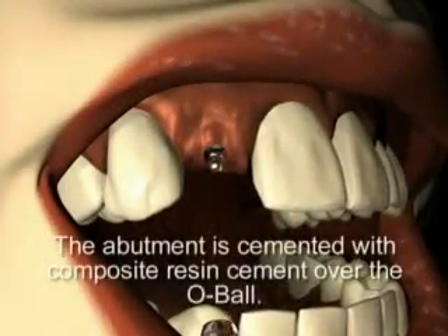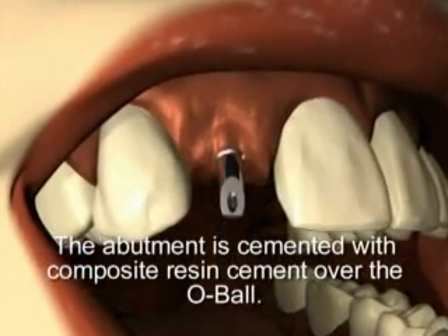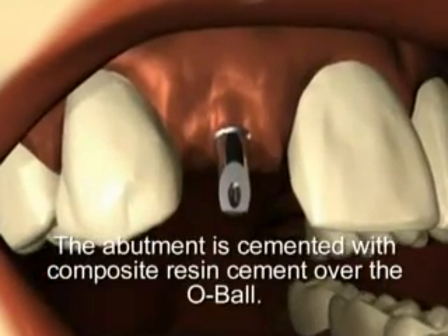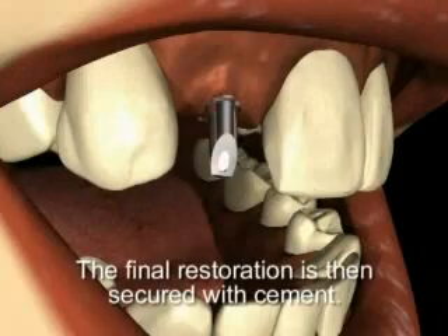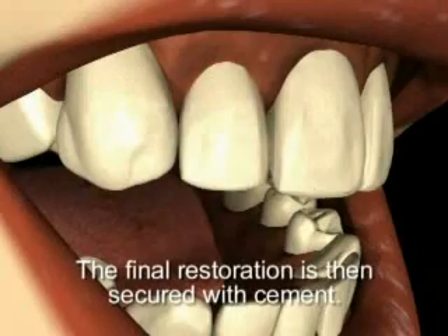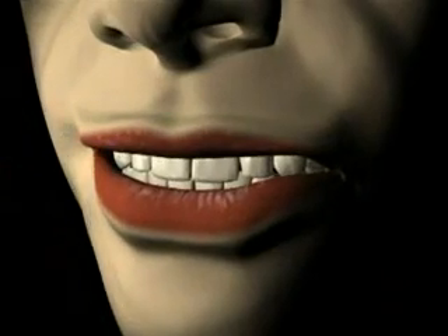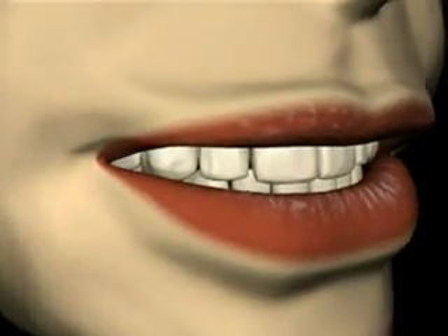The selected abutment is prepared and the final restoration is fabricated. The abutment and restoration are returned from the lab, the abutment is placed in the mouth, and if clinically acceptable, is cemented with resin cement — only a resin cement is acceptable. The final restoration is placed and fit, aesthetics, and proper occlusion are confirmed both visually and radiographically. Upon confirmation of all parameters, the restoration is secured with cement.